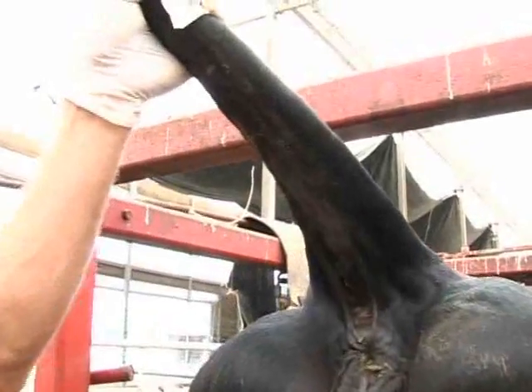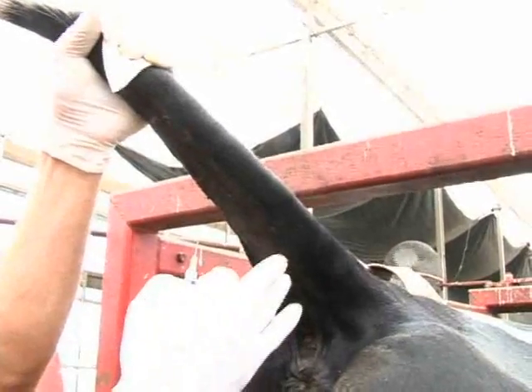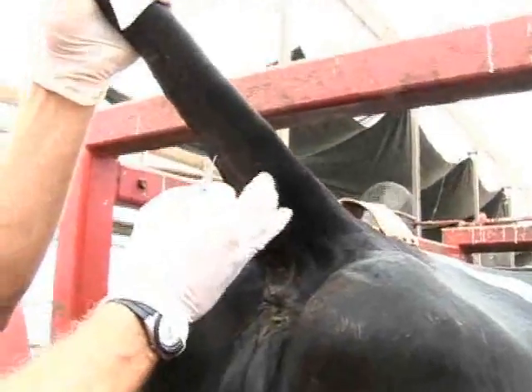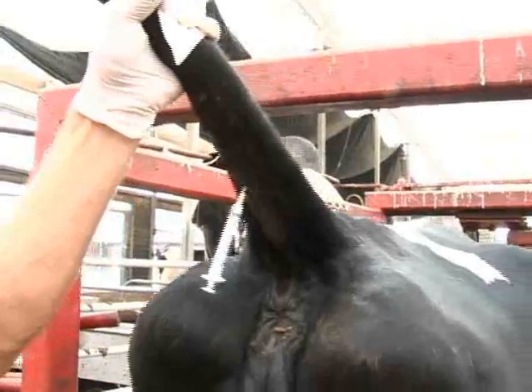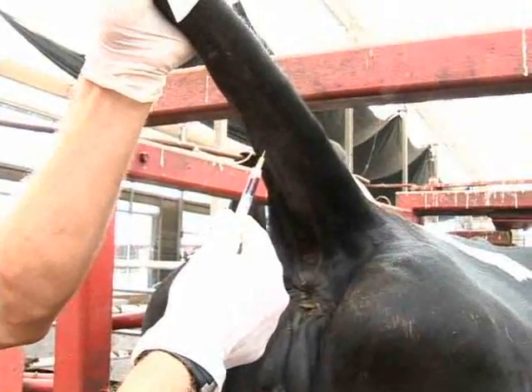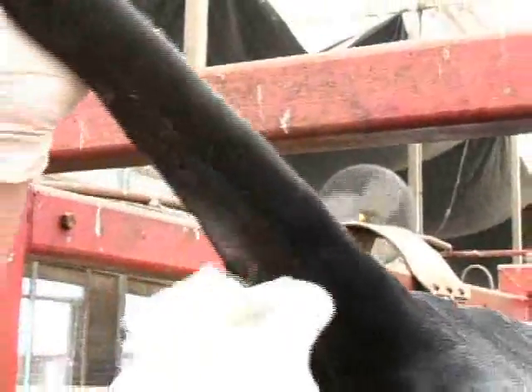We'll use a small syringe with a needle, steady our hand onto the side of the cow's tail, then aim for midline. We'll insert the needle into the tail, hopefully entering the coccygeal vein or artery, then pull back to obtain a blood sample from the coccygeal vein.